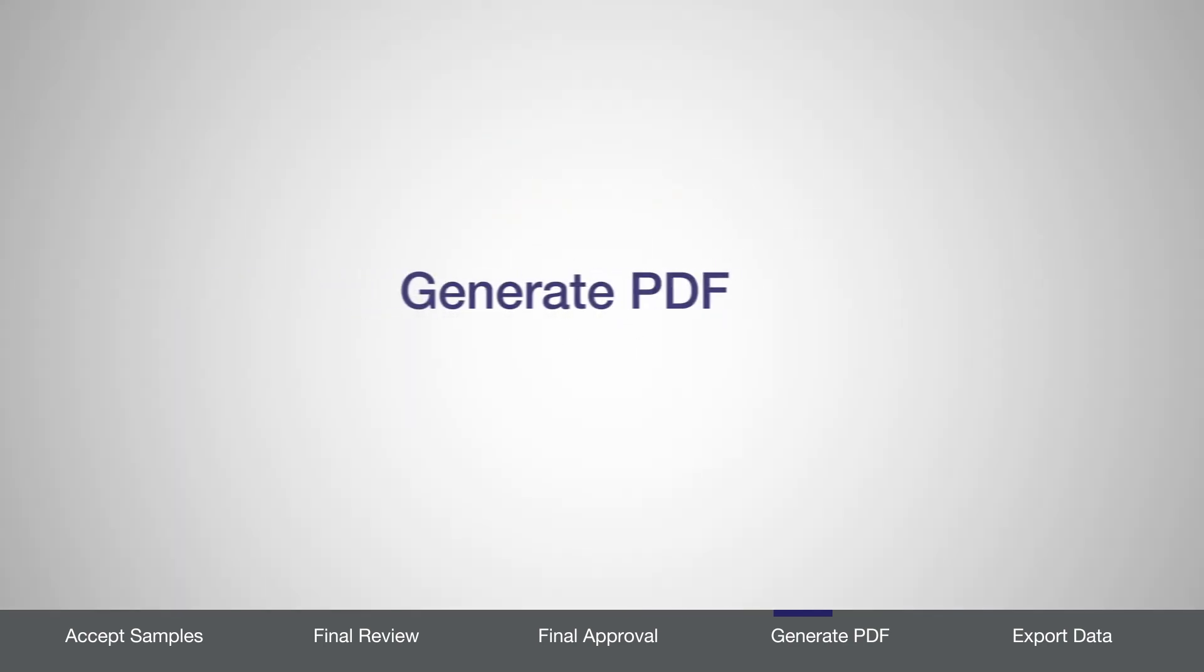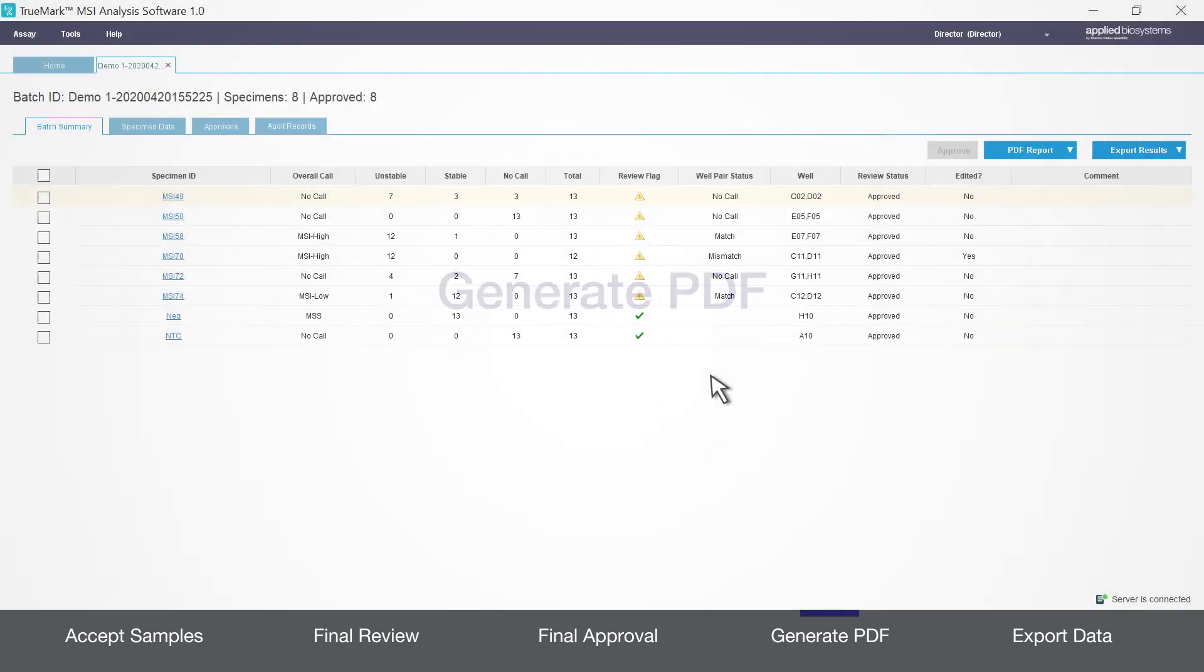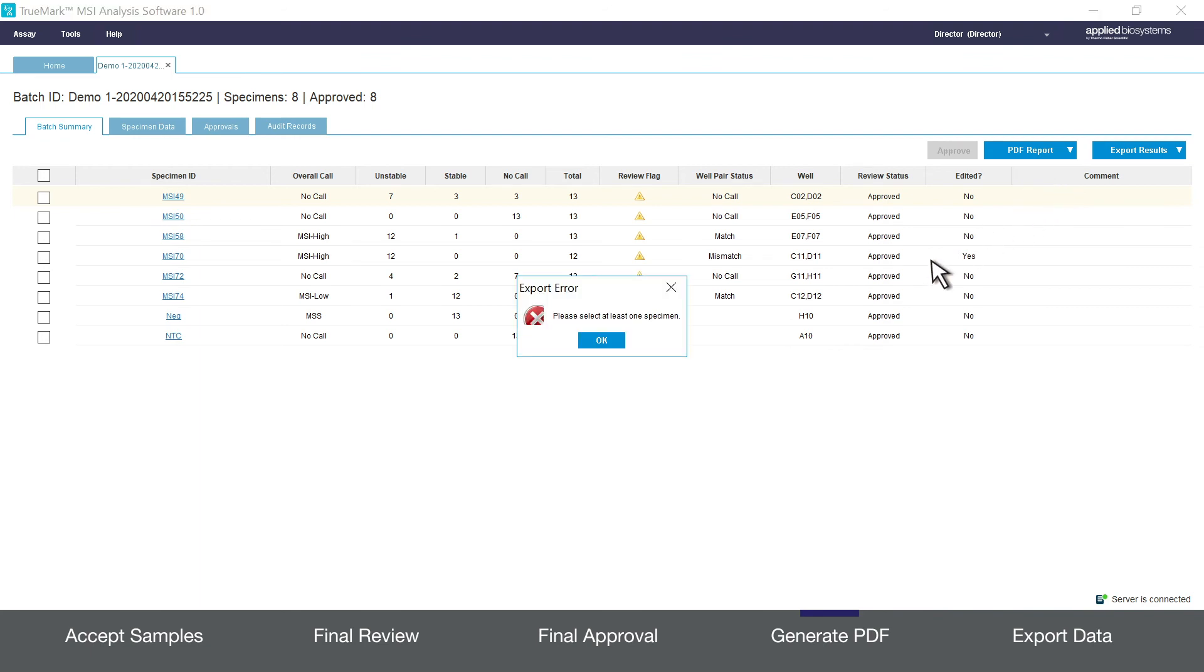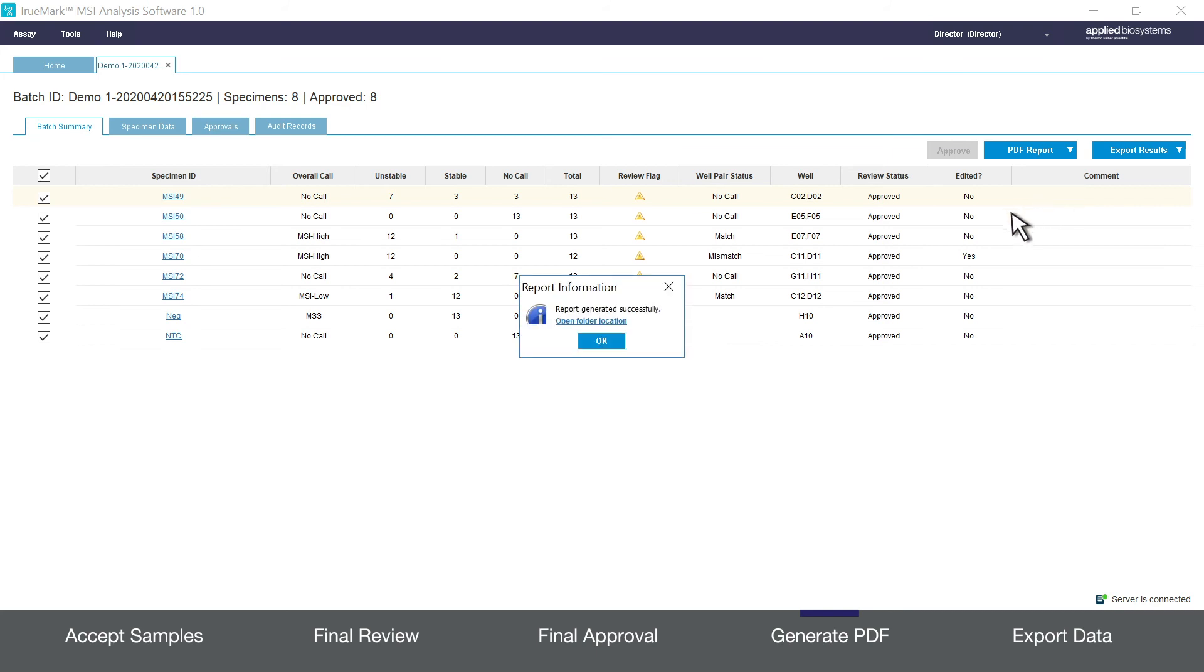Now I'll demonstrate how to generate a PDF file of your data analysis results. From the batch summary tab click PDF report. Select if you want a batch summary level or a specimen level report. The latter being more detailed. If you choose the specimen level report you must use the checkboxes on the left side of the screen to choose which ones you want reported. Once the PDF is generated the software will notify you and you can click to open the report folder.